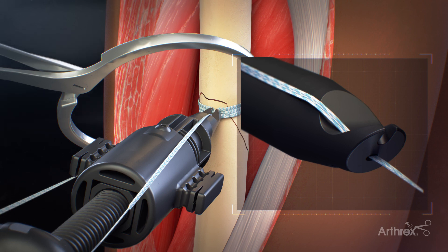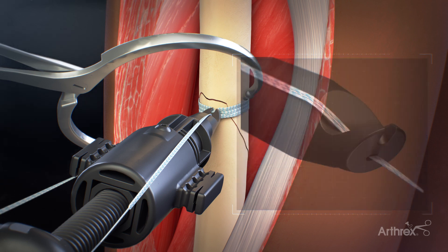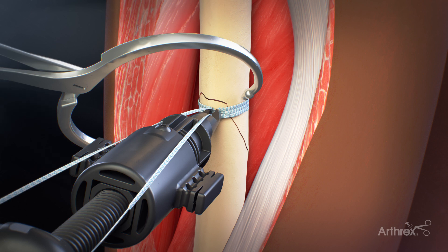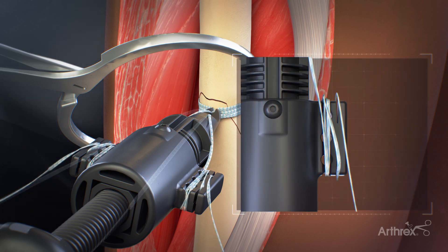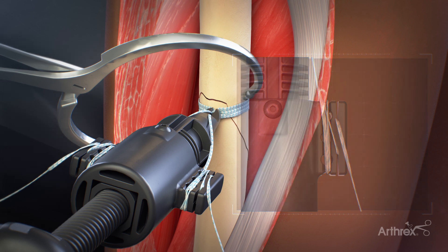One limb is inserted through the bottom hole at the tip of the tensioner and the other limb through the slot on the top. Place the tip of the tensioner down to the bone and directly on top of the knot. Wrap one suture tail at least twice around the main body of the suture wing and then secure the tail in the cleat.